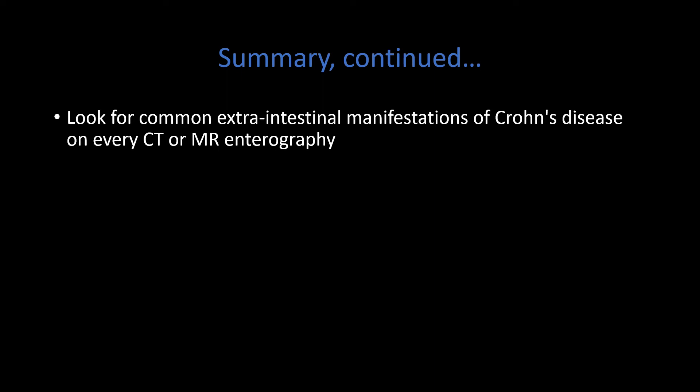The main emphasis of this screencast is to give examples of the common things we see, but most importantly to remind you to have a checklist on every Crohn's patient at the end of your CTE or MRE. Go through that checklist: Are there gallstones? Have they had a cholecystectomy? Do I see any kidney stones? Do I see evidence of pancreatitis or cholangitis? Do I see sacroiliitis or avascular necrosis? If you check off those six boxes on every case, you will improve your sensitivity for extra-intestinal manifestations of Crohn's disease.